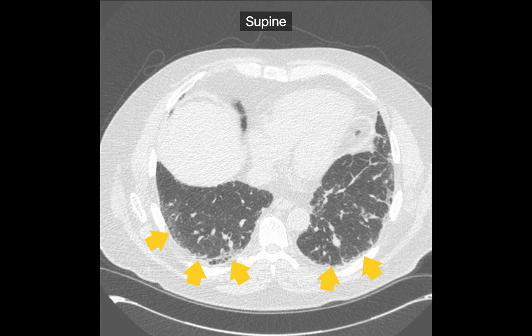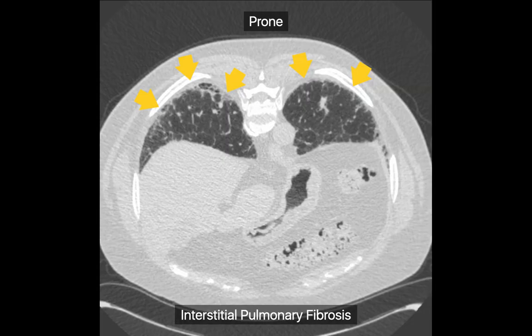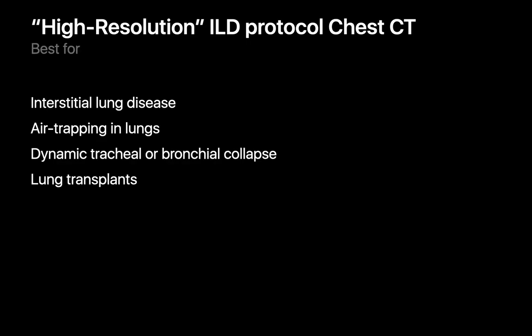Prone images are sometimes included since it can be difficult to tell if subtle opacities along the posterior margin of a lower lobe are true interstitial fibrosis or just dependent atelectasis. By flipping the patient over, we can tell the opacities in this case are true interstitial fibrosis, since the opacities would have gone away if they were dependent atelectasis. So ILD protocol chest CTs are usually good for interstitial lung disease, air trapping, and dynamic airway collapse. Since air trapping and dynamic airway collapse are features we also look for when assessing for lung transplant complications, ILD protocol chest CTs are preferred when imaging many lung transplant patients too.